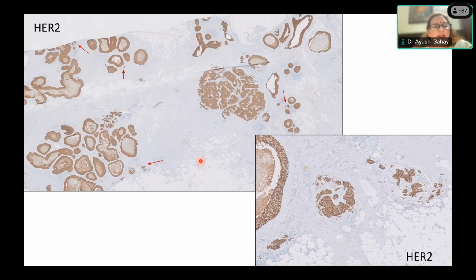They can be focal, they can be multiple. So if you only take 1 or 2 sections because it was just called DCIS, you are going to end up missing foci of microinvasion as well as maybe foci of larger invasion. So please be sure to sample what has been called DCIS on the core biopsy extensively. So that's again, thank you, Aisha, for pointing out.